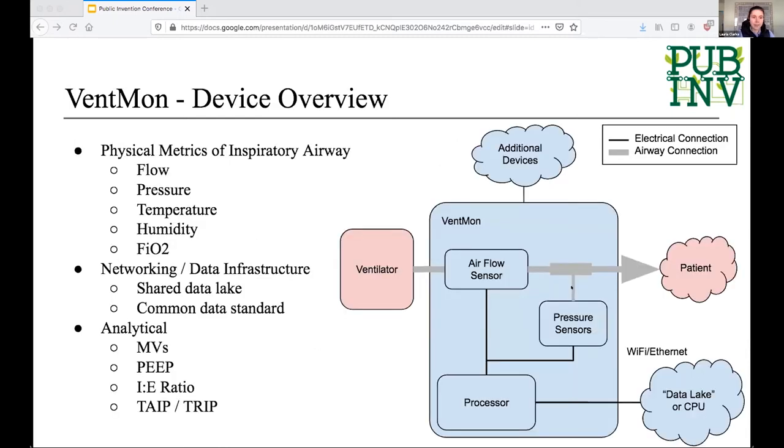Inside the Ventmon, we measure a few key components — key metrics of the inspiratory airway. We use a flow sensor to measure the flow of air through the airway. We measure pressure and the pressure differential between ambient pressure in the room and pressure in the airway. We also measure the temperature of the air in the airway, its humidity, and the fractional oxygen of the air. All this data is collected and sent to a data lake, and then analyzed using software to create the key clinical metrics you would see on a ventilator in a hospital.